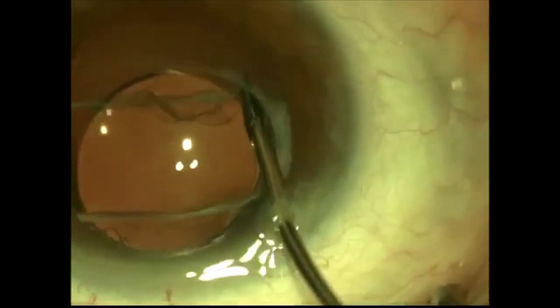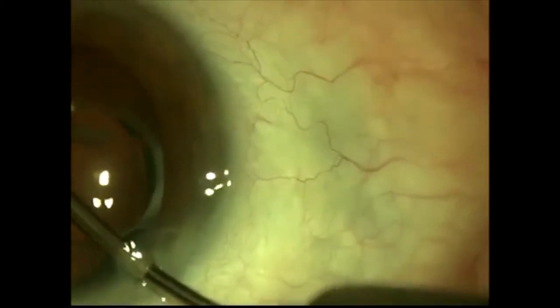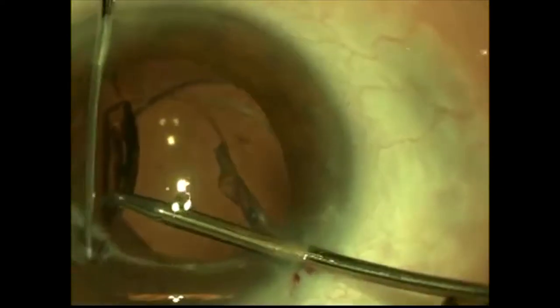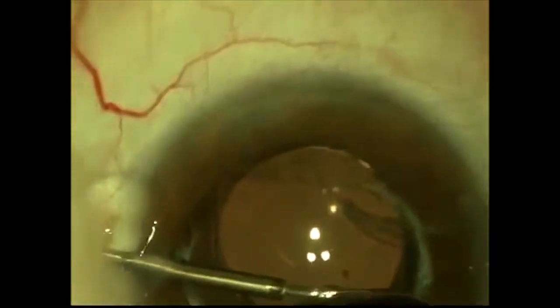These traction forces, sort of like a muscle flexion, cause the lens to enter into the Z position. There's no need really to remove it — often removing these fibrous membranes or reinflating the bag is sufficient. In this case, the patient is almost two years out from surgery and had never seen well out of this eye. The surgeon had done several capsulotomies and tried to reposition the lens intraoperatively. Here you can see the haptic is in front of the anterior capsular leaflet. We're carefully dissecting because wherever those haptics are, there are usually strong membranes.